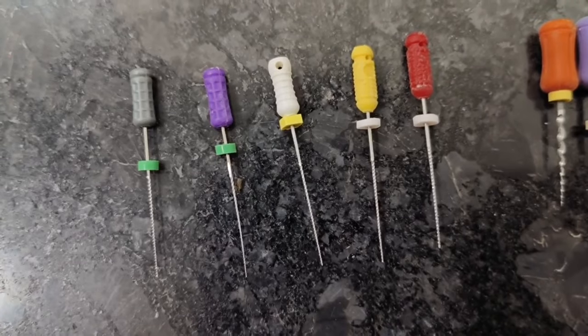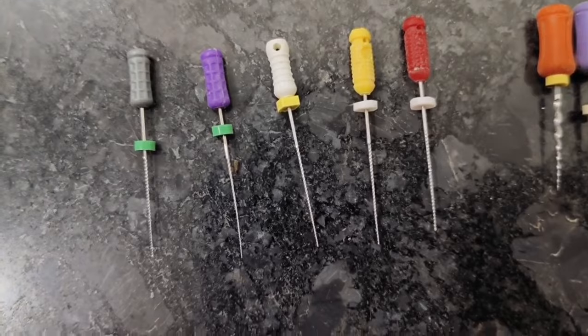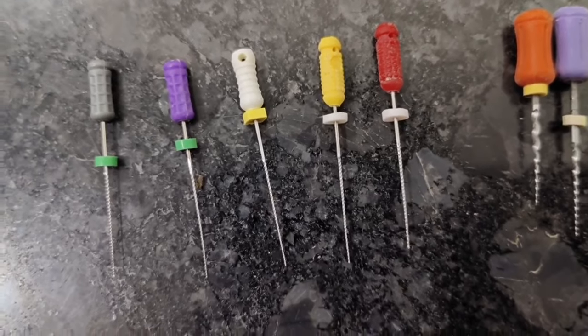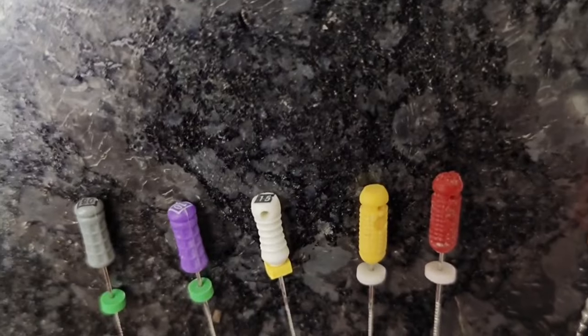So number 8 file is the gray color, number 10 file is the purple color, number 15 file is the white color, number 20 file is yellow, and number 25, which is otherwise known as the master apical file, is red. So these are all K files, and you can find the numbers at the back: 8, 10, 15, 20, 25.